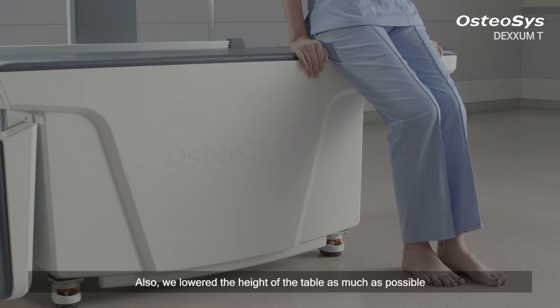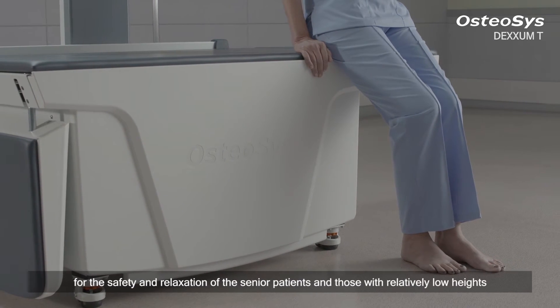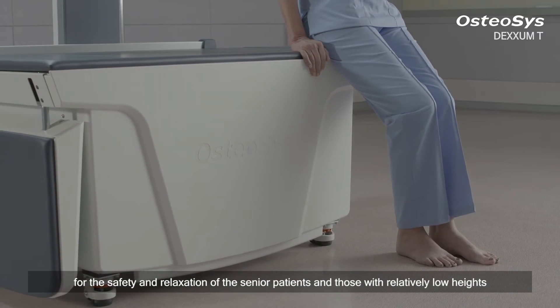Also, we lowered the height of the table as much as possible for the safety and relaxation of senior patients and those with relatively low heights.